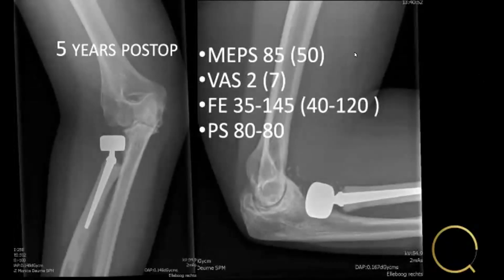At just 5 years follow-up, the Mayo Elbow Performance Score is 85, came from 50, from poor to good. The VAS score is only 2, she's very happy with this. The flexion extension arc has more or less stayed the same, 35 to 145, whereas before it was 40 to 120, and pronation-supination stayed the same as pre-op. But again, quite a happy patient.